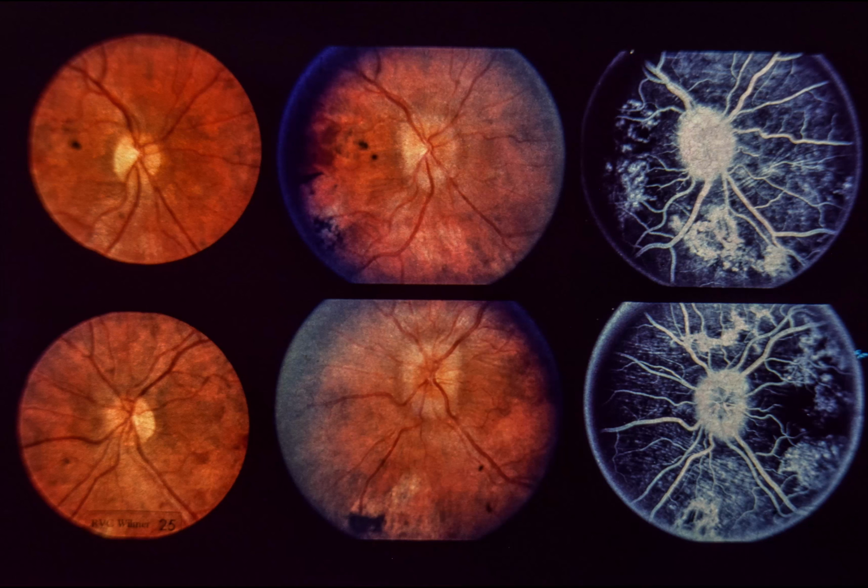Peripapillary retinal pigment epithelial changes are prominent in both eyes. Upper right and lower right. A fluorescein angiogram demonstrates leakage from both optic discs and accentuates the peripapillary pigment epithelial changes. The alternating areas of hyper and hypofluorescence may reflect swelling of superficial choroid and retinal pigment epithelium that probably occurs in this disorder. The patient was treated with steroids with resolution of optic disc edema and improvement in visual acuity.